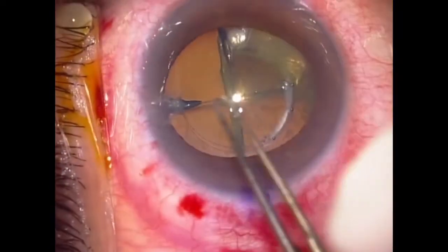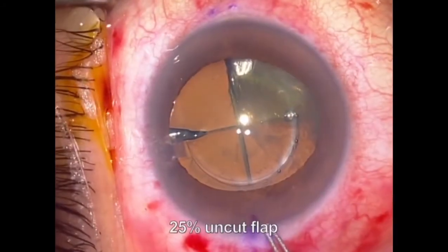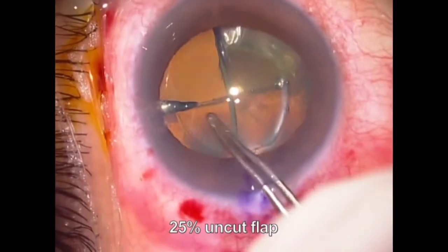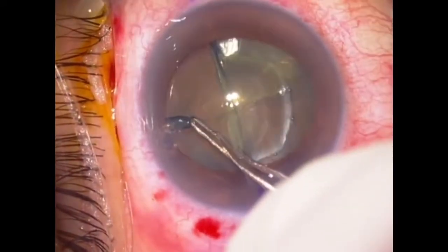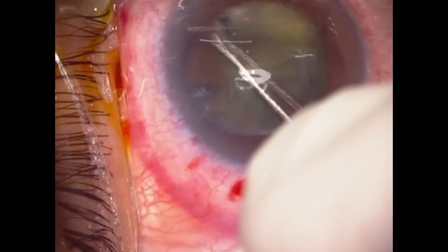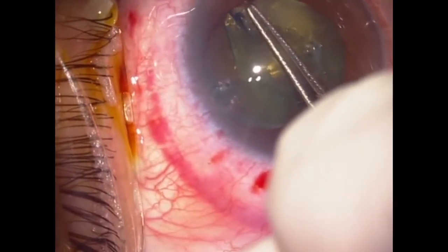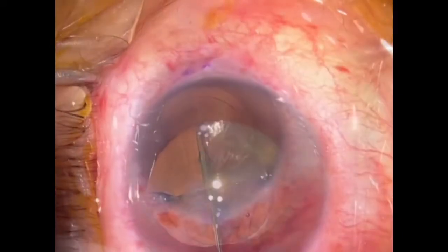There is some controversy about the strength and completeness of a femto CCC. Here we see a femto CCC with a whole uncut quadrant. Truth be told, managing this large uncut capsule is not difficult if one is familiar with manual capsulorhexis. It is harder reconciling the fact that such an expensive machine can fail to deliver what is promised.